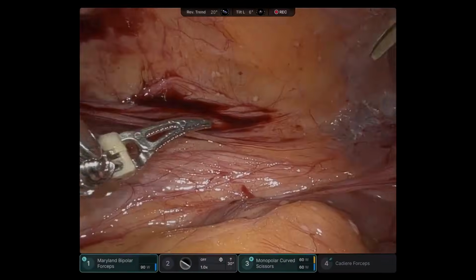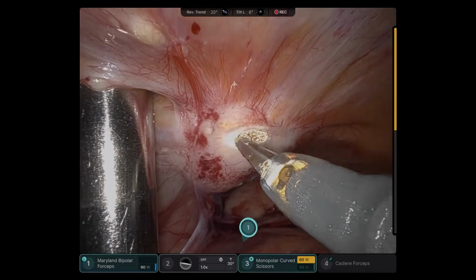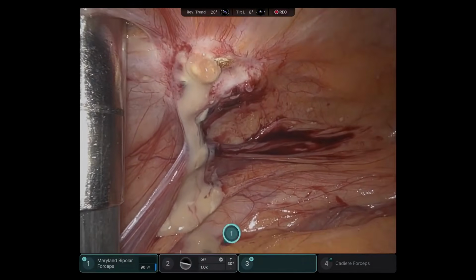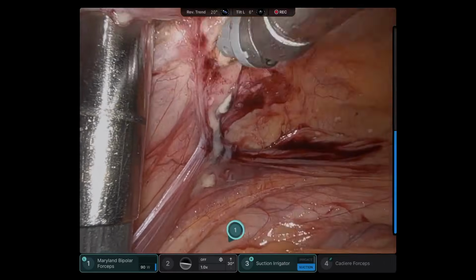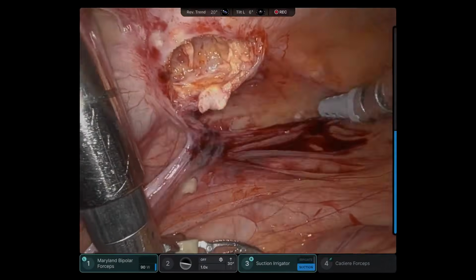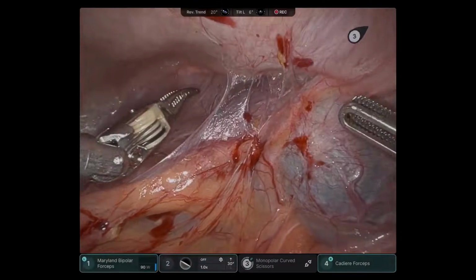Hi, this is Abubaker. I'm showing a video here of a patient that had perforated diverticulitis over a year ago, and this was complicated postoperatively with development of an abscess next to segment 7 of the liver. She's been treated with IR drainage at least 3 times, and she keeps getting reaccumulation of the abscess.